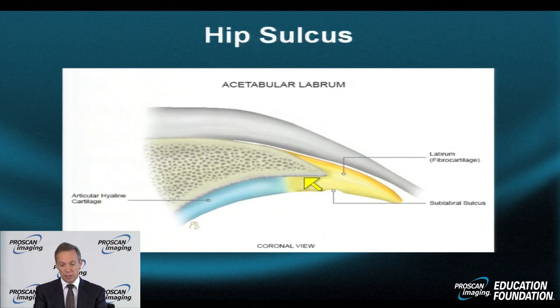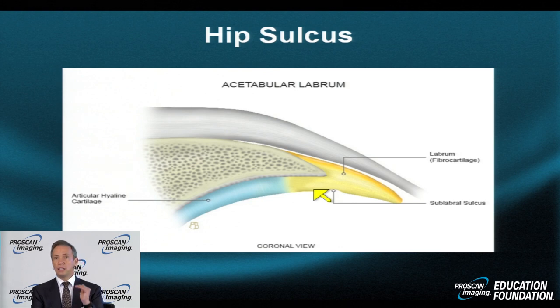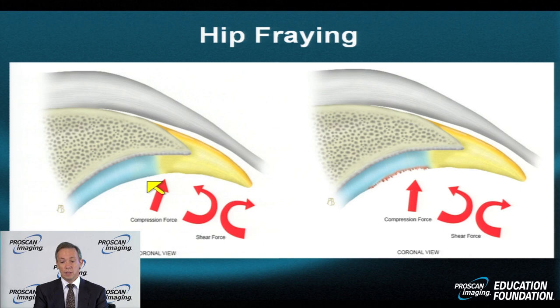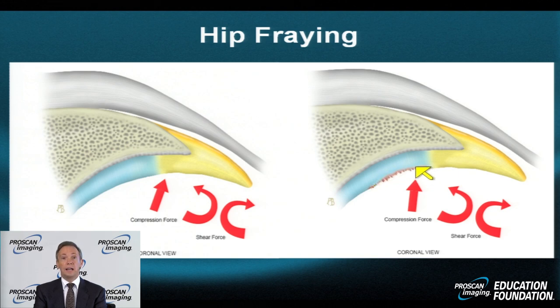Here's an example of a sublabral sulcus — shallow, without depth, without cysts, without inflammation. The sulci can extend all the way anteroinferiorly and often deepen in the anteroinferior quadrant of the hip. Fraying and injury of the hip commonly occurs with a combination of compressive and shear forces, which together may produce fibrillation, thinning, and slight irregularity. This is prominent on the hyaline cartilage side but harder to recognize on the labral side unless a substantive effusion is present.